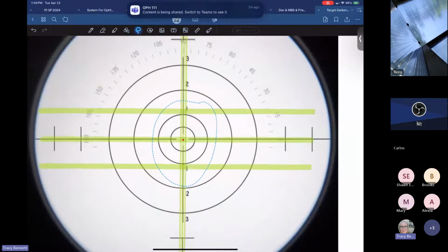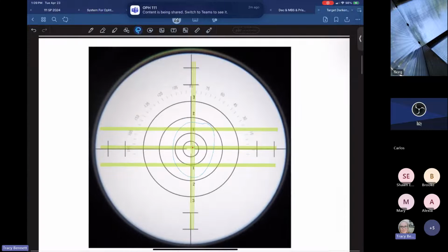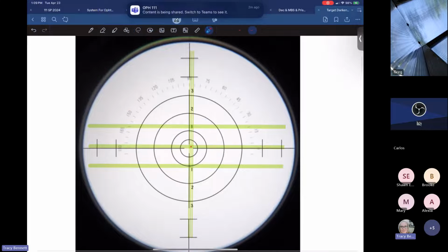So if we move up from here straight up on this line, let me go back. We also have this little scale here going. You see this one in the background, right? You see we got 0 up to 90 over to 180. You can move this prism line, and you can move it and spin it around.